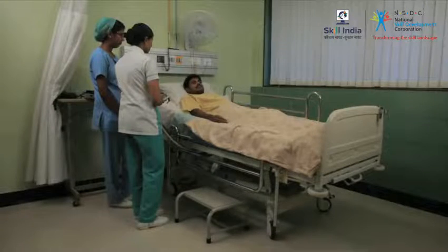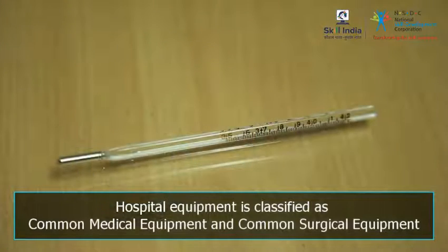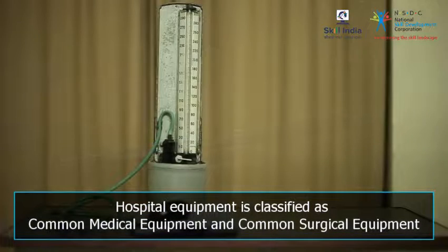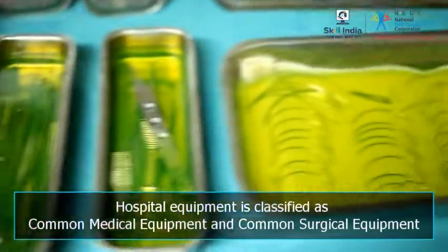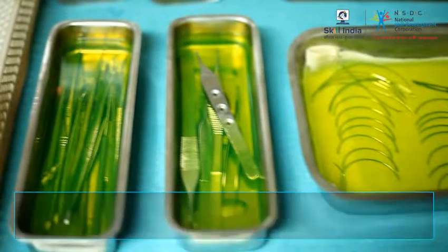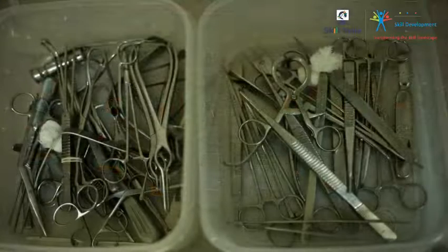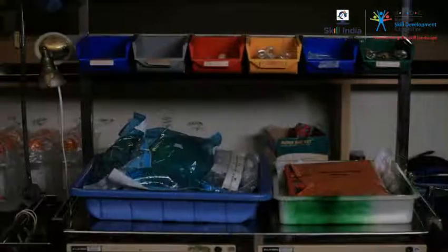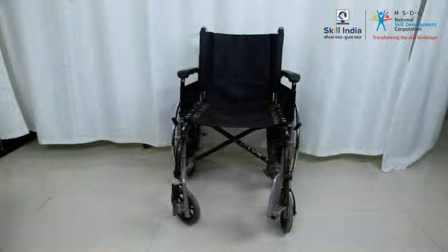You should be aware of the common equipment that is used by the doctors and the nurses during the procedures. The equipment used in the hospital is broadly classified as common medical equipment and common surgical equipment. In addition to the medical and surgical equipment used in the hospital, you should be aware of the equipment that is used to manage patient activities.